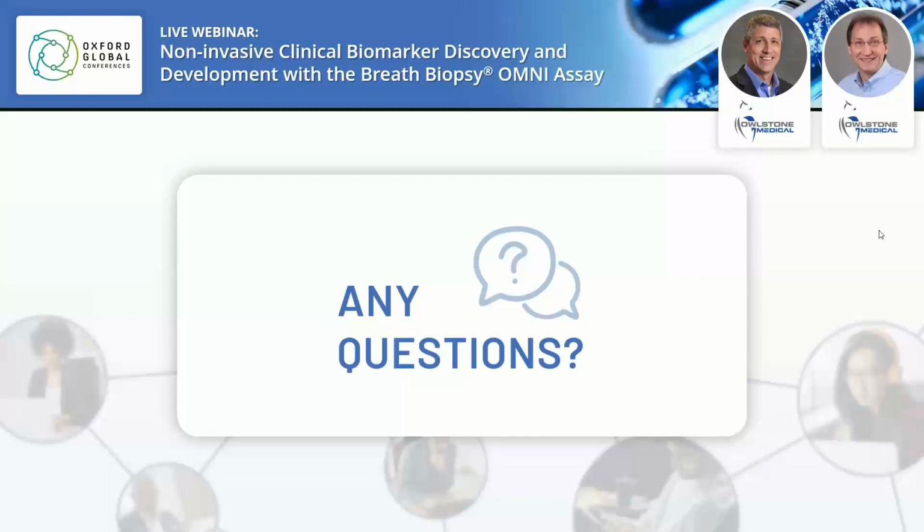Is there a washout effect for VOCs present in only low concentration with repeated breath sampling? Can you repeat that again? Is there a washout effect for VOCs present in only low concentration with repeated breath sampling? Great question. If they're endogenous molecules and they're low level, I would expect they would retain their low levels and not necessarily be washed out or dropped with repeated sampling. But I haven't really seen data on that, so it's hard to answer.